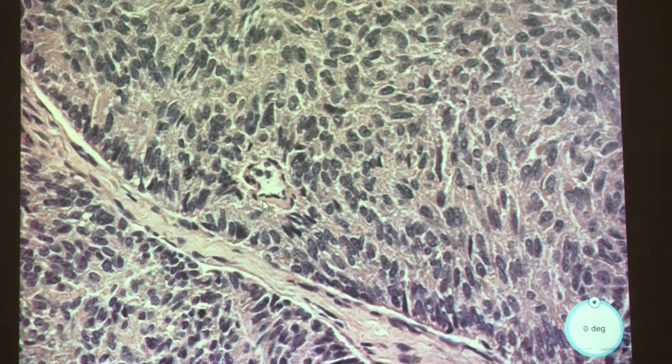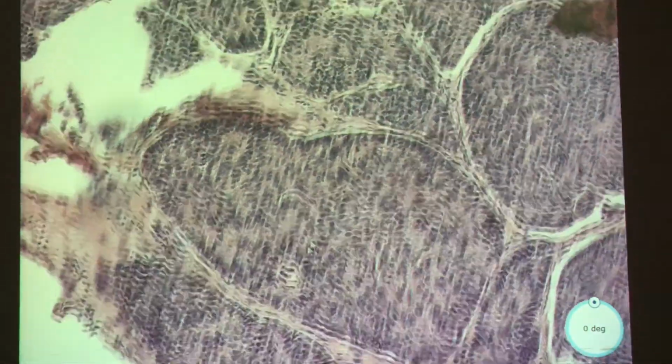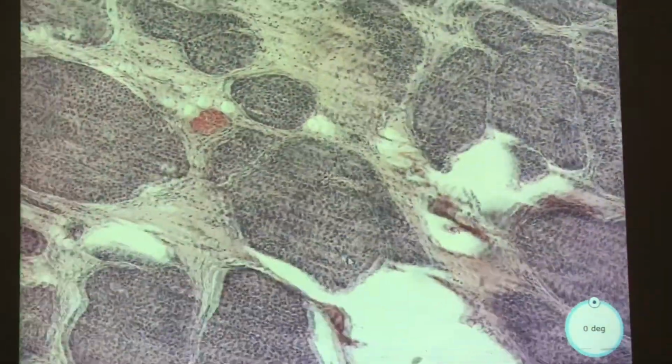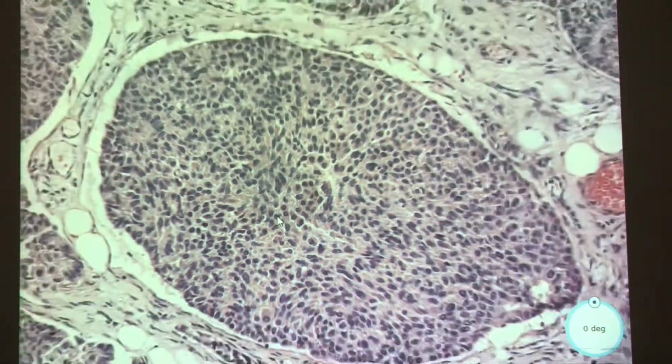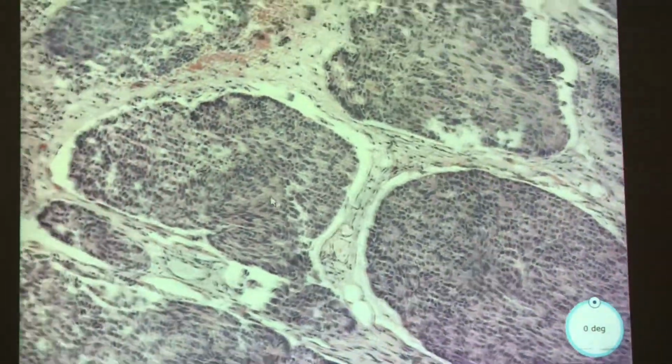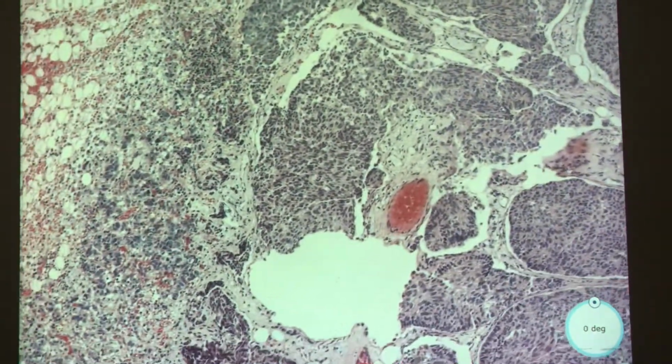What is that? I think there's a blood vessel? Yeah, I think there's some better examples later on, but yeah, you're going exactly the way I want you to. This is great. So, first off, this is definitely something to be very concerned for.